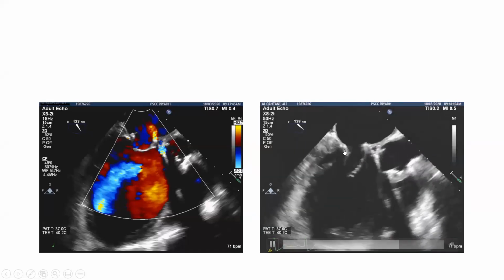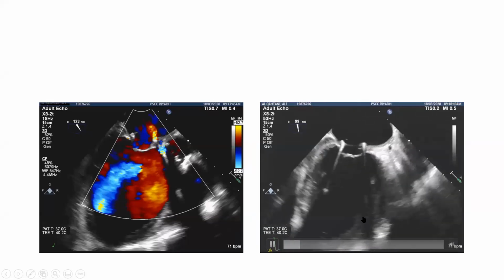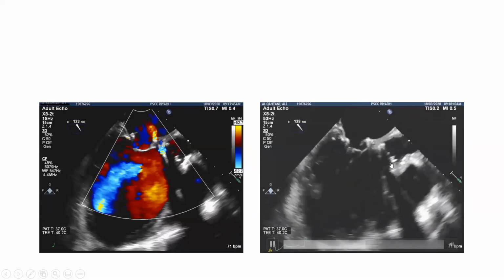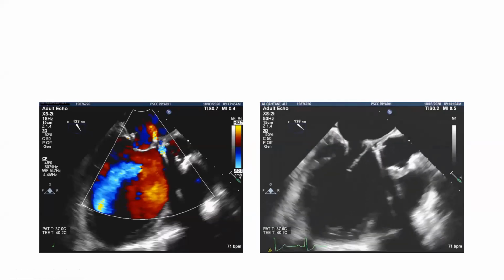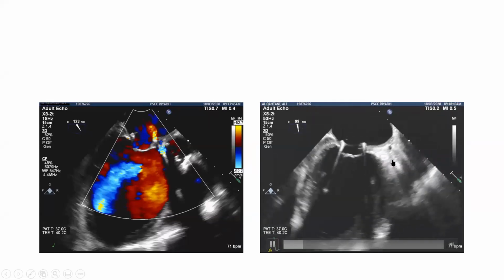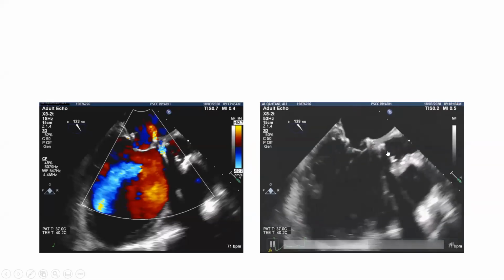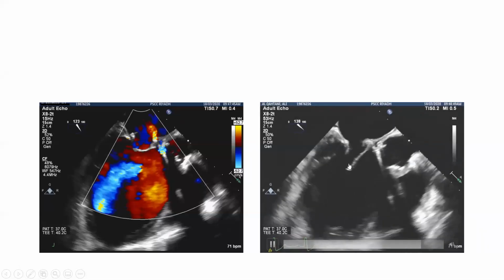Of course, what is this? Who will tell us what is going on in the mitral and what is going on in the aortic, or what prosthesis they put in the mitral and the aortic? Like a disc. This we didn't tell yet about. What about the aortic first? Start with the aortic. Mechanical, because there's a shadow in here. Yes. What about the mitral? It's a difficult question.